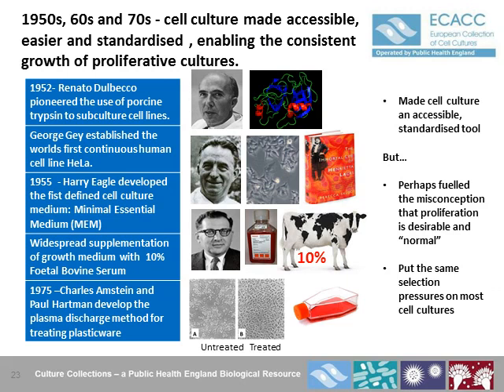Historically, glass vessels were used for cell culture. The new generation of polystyrene flasks held a great potential. They could be made sterile, disposable, and they were optically perfect. However, they had one major drawback. Their hydrophobicity made them unsuitable for cell attachment. Before they could be used, they'd have to be coated in collagen.